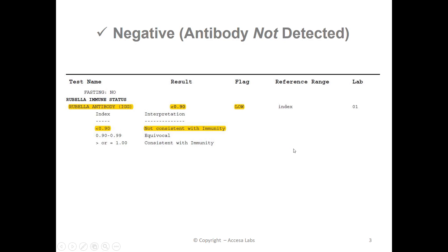Now let's take a look at a negative result. Once again, we look under the result heading. This report has a result of less than 0.90. You might also notice the low marking under the flag header. Based on Quest Diagnostics Result Index, any result less than 0.90 is not consistent with immunity. Therefore, this sample report represents a negative result.